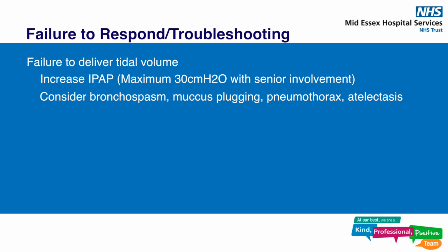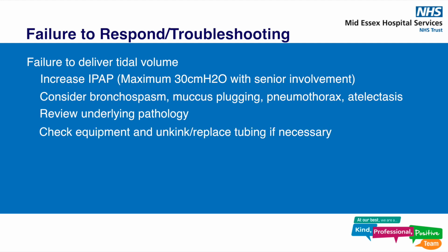Consider bronchospasm, mucus plugging, pneumothorax or atelectasis as a cause and treat accordingly. Ask a doctor to review the underlying pathology and optimise treatment. Check equipment and unkink or replace any tubing if necessary.